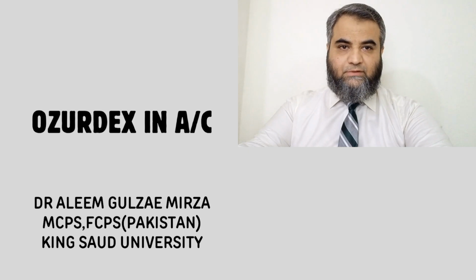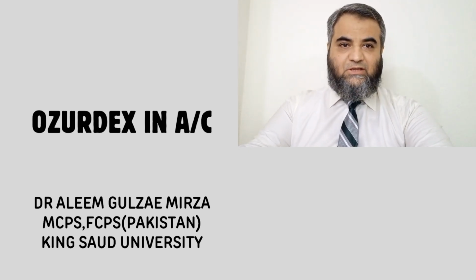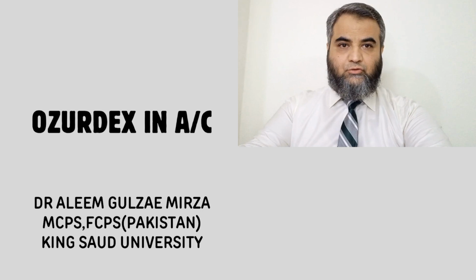Today, my topic of discussion is OZURDEX, an injectable dexamethasone implant which is used for the management of macular edema due to branch retinal or central retinal vein occlusion or non-infectious posterior uveitis.